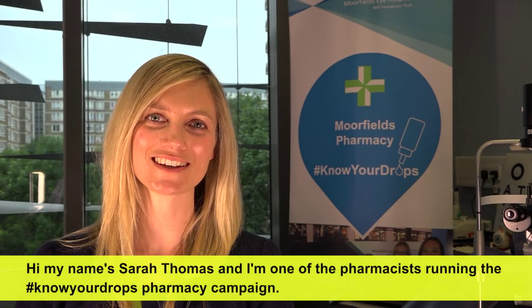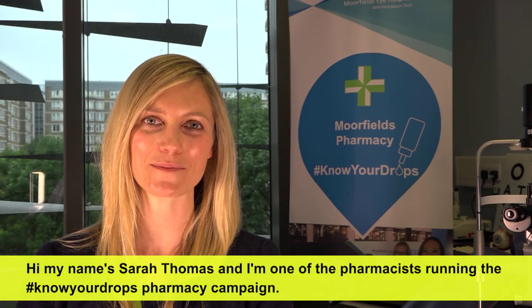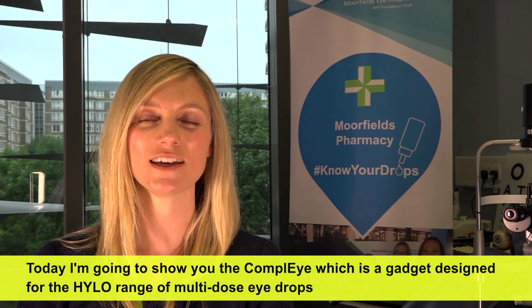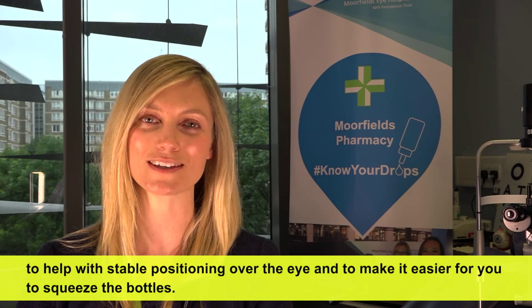Hi, my name is Sarah Thomas and I'm one of the pharmacists running the hashtag Know Your Drops Pharmacy campaign. Today I'm going to show you the ComplEye, which is a gadget designed for the HYLO range of multi-dose eye drops to help with stable positioning over the eye and to make it easier for you to squeeze the bottles.